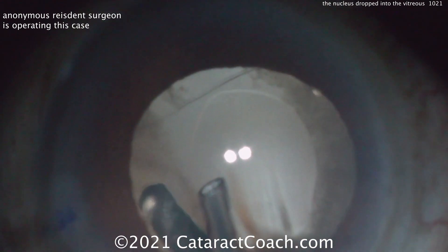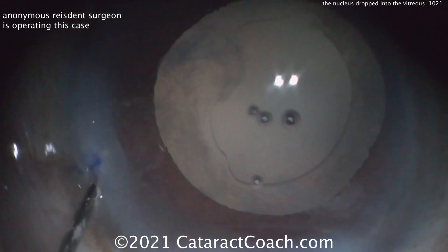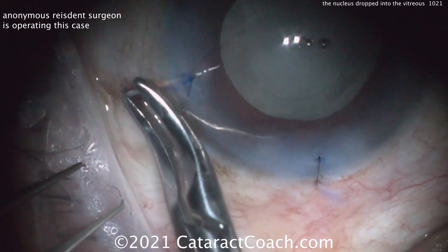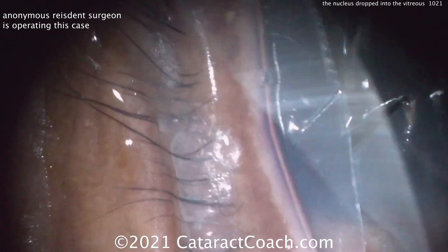Here at the end, looks pretty good. Cortex has been removed and there is sufficient support. Should you put a lens in now? Do the triamcinolone wash. Actually, let's leave the eye aphakic — let the retina person finish the vitrectomy. You'll go back for a secondary IOL. This patient will be okay.